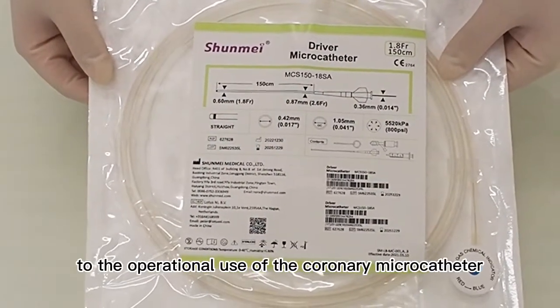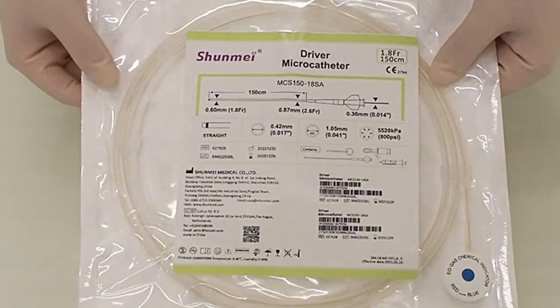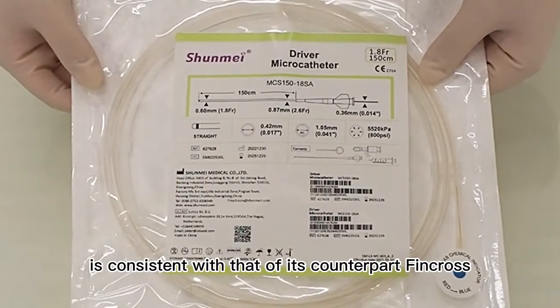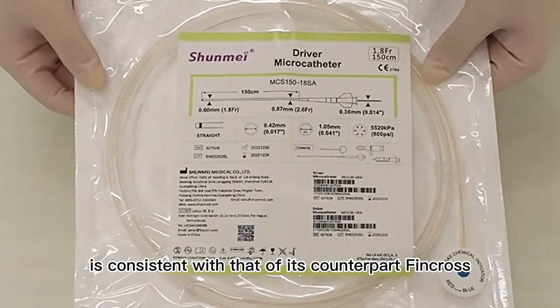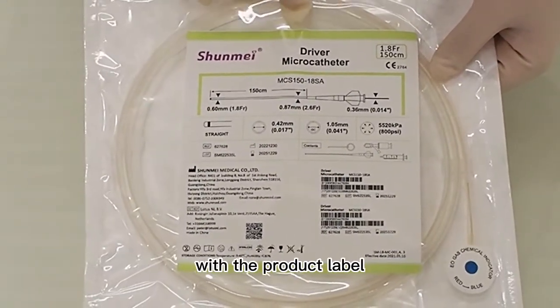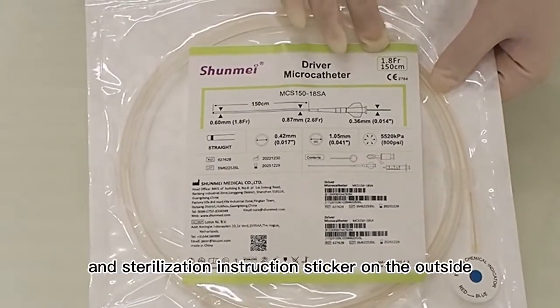Today we introduce you to the operational use of the coronary microcatheter. The performance of this product is consistent with that of its counterpart, FinCross. The first thing you see is the square sterilization bag with the product label and sterilization instruction sticker on the outside.